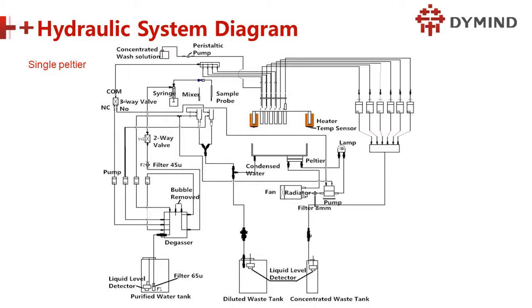How to clean it? Because in the hematology machine we have a chamber and we have a drainage part, and that chamber is not consumable, right? So there's a hole at the bottom, and we have a pump to pump the water out to do cleaning, right? But here the principle is different. We are using the wash station to do the cleaning. So you can see the pure water comes in here. This is the station here, right?